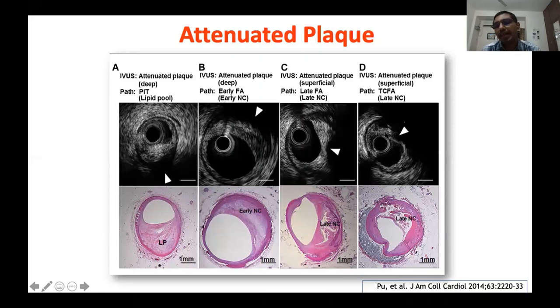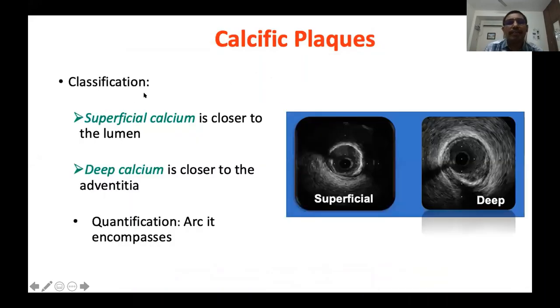IVUS doesn't have the resolution to confirm thin-cap fibroatheroma directly — it is indirectly evidenced by attenuation closer to the lumen. Fibrocalcific plaque is classified based on location: superficial calcium is closer to the lumen, and deeper calcium is closer to the adventitia. Calcium extent is quantified by measuring the arc it encompasses in degrees — for example, this calcium encompasses 200 degrees along the circumference.